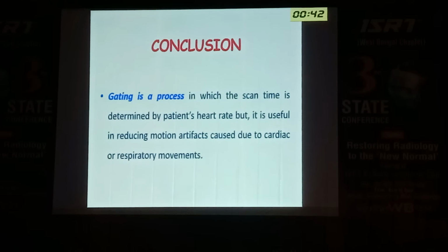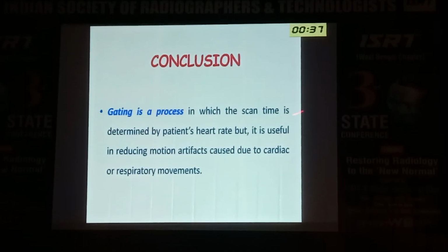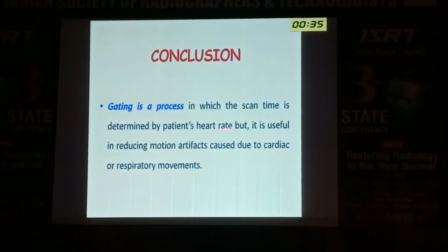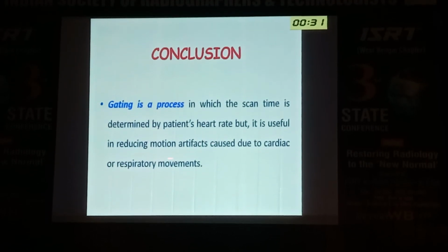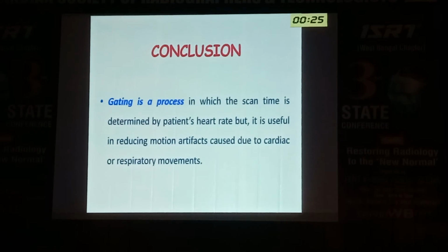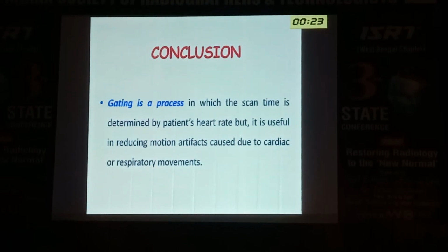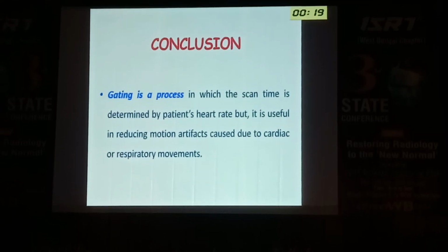When you are going to image the involuntary movement, gating is the process in which the scan time is determined by the patient heart rate, and it is useful in reducing the motion artifacts caused due to cardiac or respiratory movement. You understand? So this is the message I want to give. Gating mechanism is a wonderful tool in imaging the moving system.